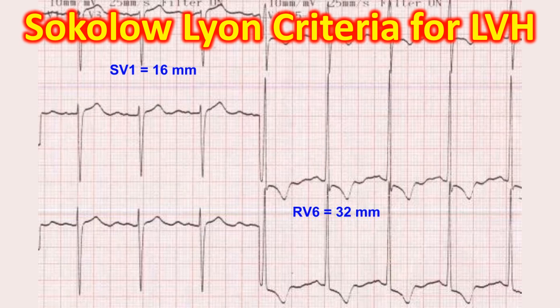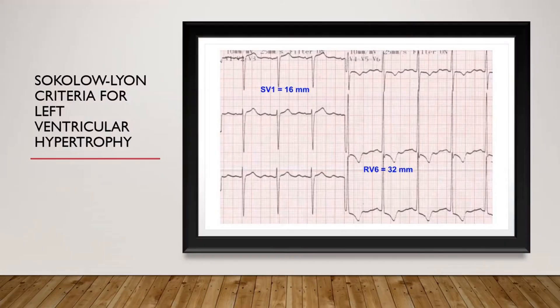Sokolov-Lyand criteria is one of the most popular voltage criteria for detection of left ventricular hypertrophy. In this ECG, we can see leads V1 to V6. The S wave in V1 is 16 mm and the R wave in V6 is 32 mm.